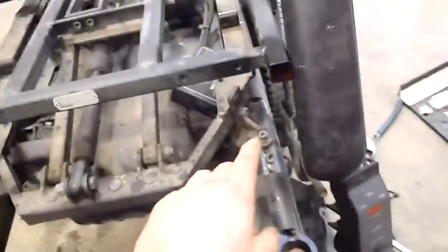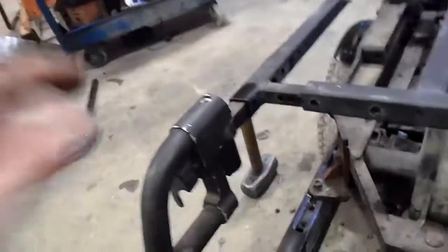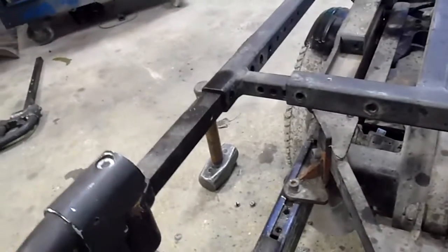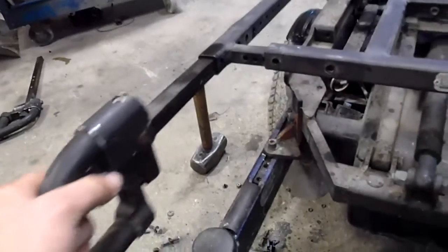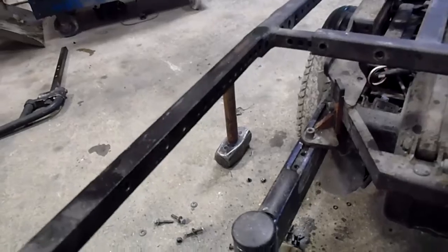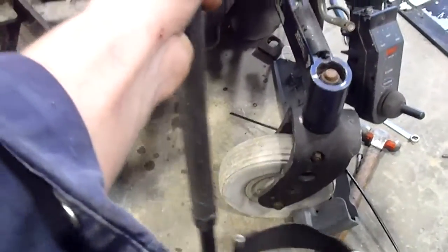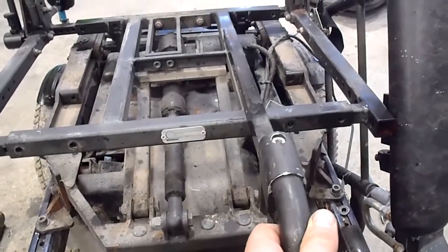I got the other footrest piece out. It just slides in and out. This side's still on. Had a ton of bolts holding this on, just 1/4 inch hardware. But see, this is totally adjustable, so it can slide. There's quite a lot of adjustment there, so I might have to try to reuse some of that tube, or I might just move these in like this to the inside. Like I was talking, I could even possibly use that tube that already is in there.